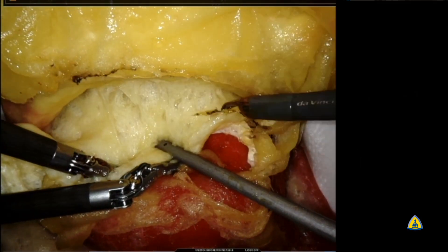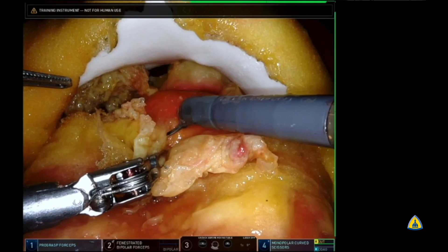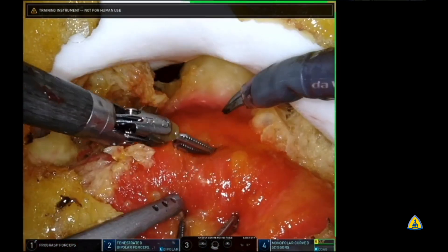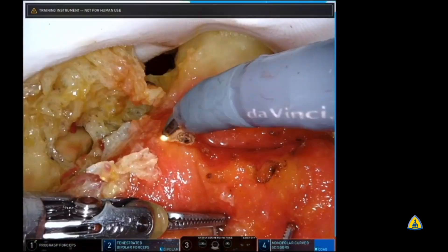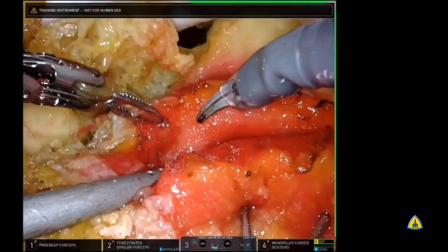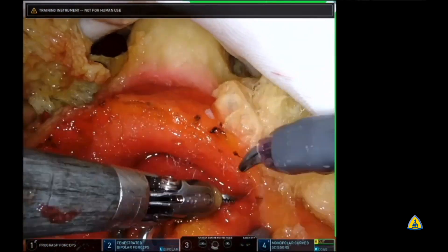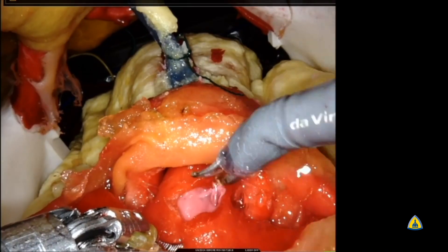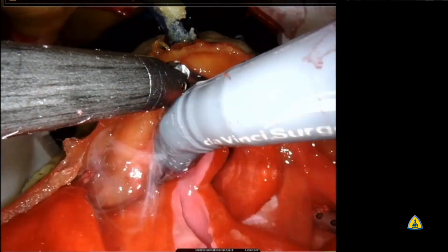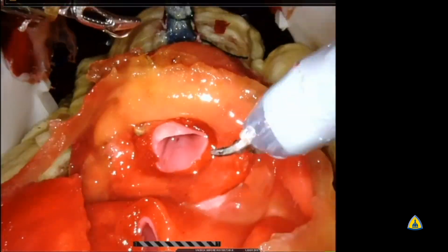This is showing the simulation in action — an extraperitoneal approach. The trainee can use cautery because this is a hydrogel. As soon as the anterior surface of the bladder and prostate is exposed and the pubic symphysis is also exposed, the trainee starts the bladder neck dissection. We've recreated the tissue planes, the texture of the bladder and prostate, and even the charring itself, creating a very realistic experience. You can see we're opening the anterior bladder neck — the mucosa is very apparent, and fluid leaking out of the bladder is also apparent, just as in real surgery.